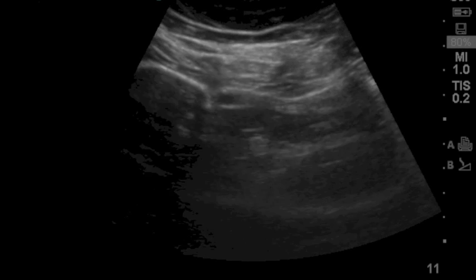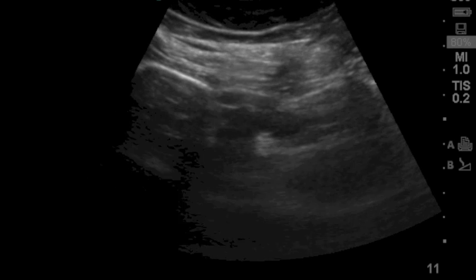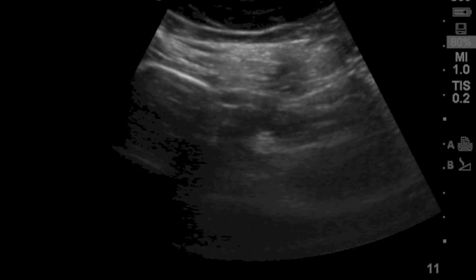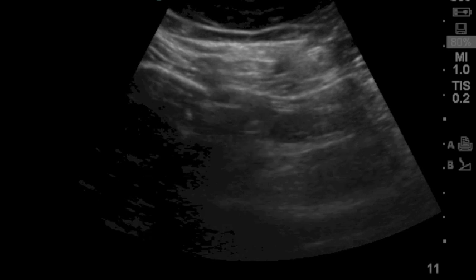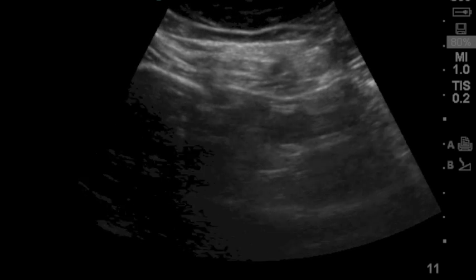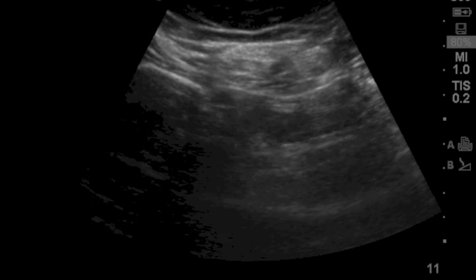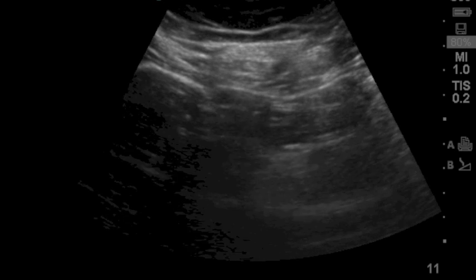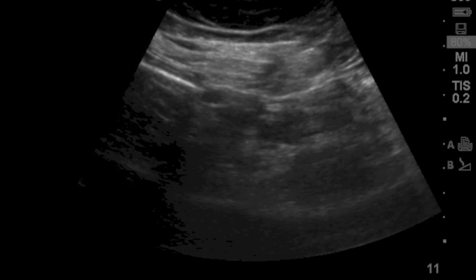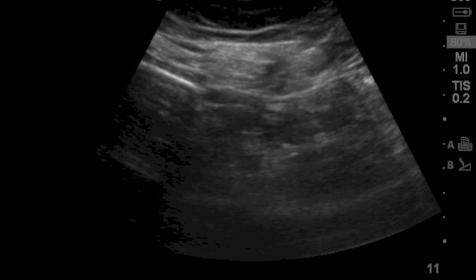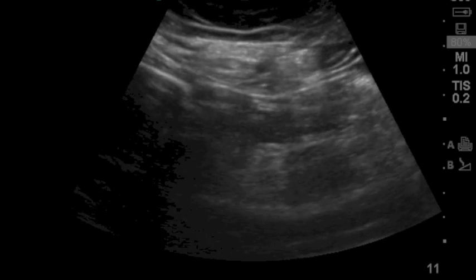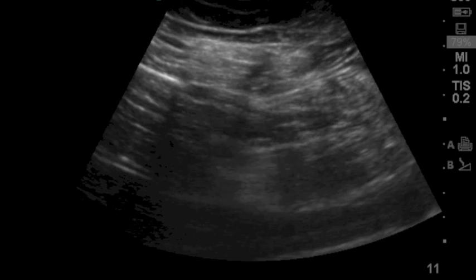In this example, this is a right leg, and you can see the femur sitting to the left side of the screen, which is lateral. Medially you can see the femoral vessels pulsating. You can also see the sciatic nerve sitting prominently in the middle of the screen. You can appreciate the needle approaching this nerve out of plane, which is how I mentioned I usually do this block. Because I want to make sure the structure is in fact the nerve and not, say, a lymph node, I use nerve stimulation as I approach. Once confirmed, I begin to infiltrate local anesthetic around the nerve on either side to ensure good spread and a strong block.